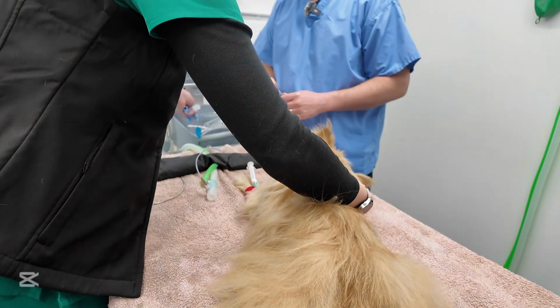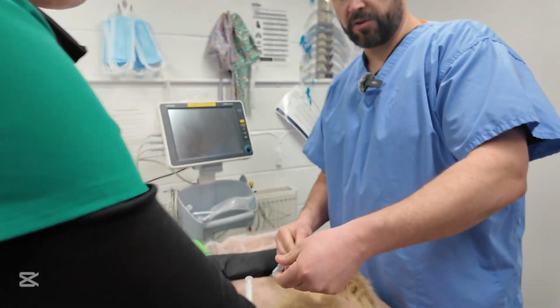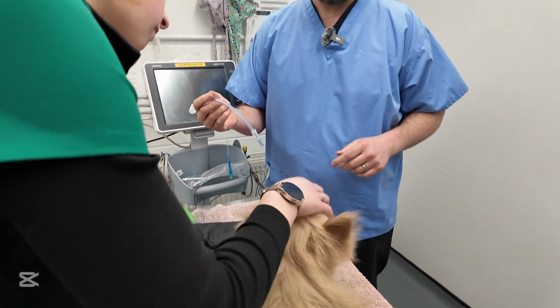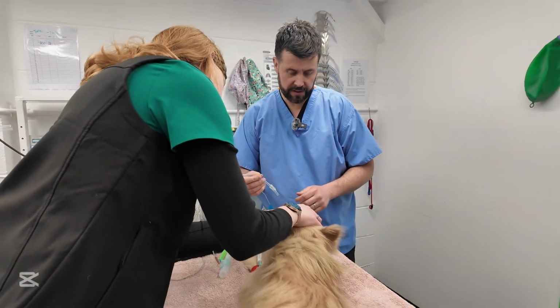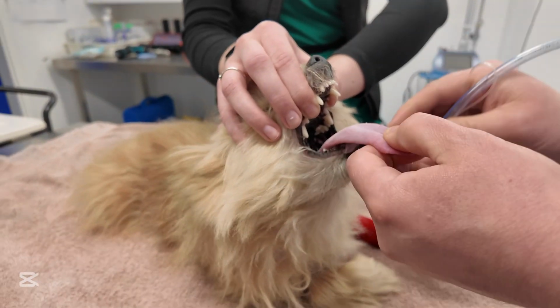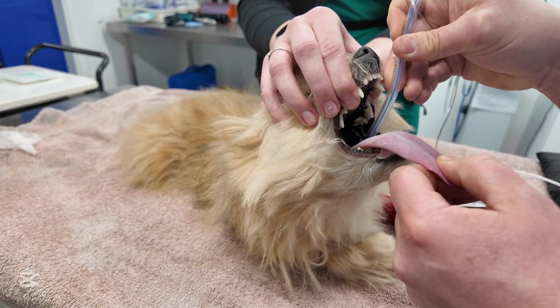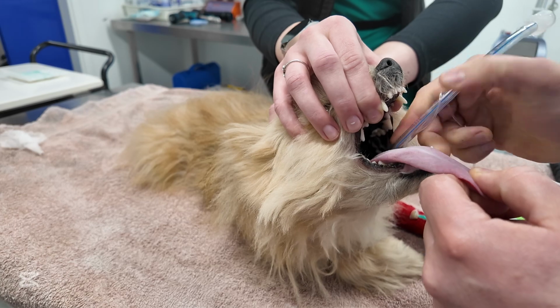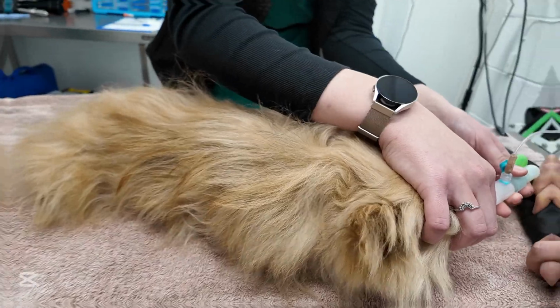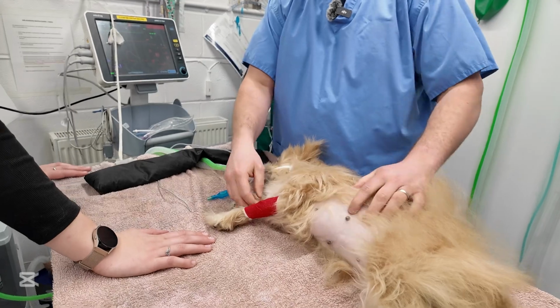I'll use this one, I think they'll be a bit big, those. So we judge the size of the tube next to the dog to work out where it's going to be in relation to the larynx. Hopefully this is about right. So you come round here, we pull the tongue down, and then we can place the tube down into the windpipe, the trachea, and then we'll be able to cuff the tube, sitting behind the larynx here.